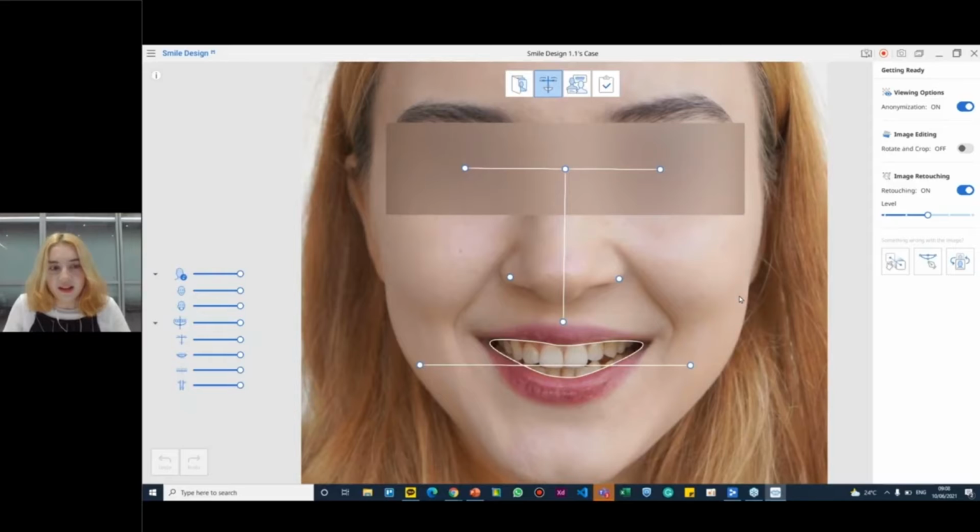And yeah, when we develop all of our programs, we use our own scan data to run the tests. We have our QA team that uses their data, and as well, we usually use our own data first of all to test our program. So developers and QA and me as well. So when you constantly look at yourself, it's kind of hard.